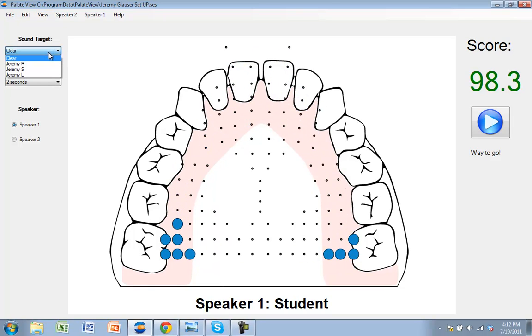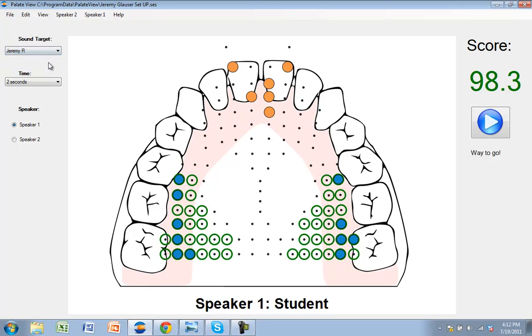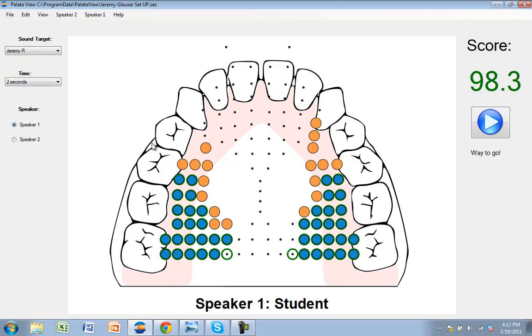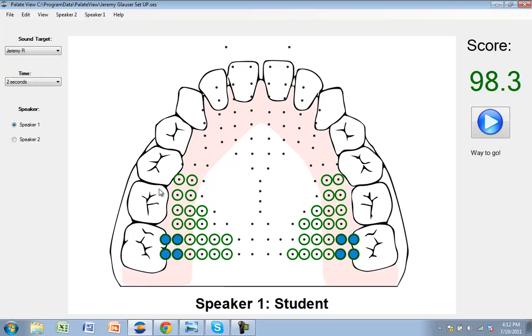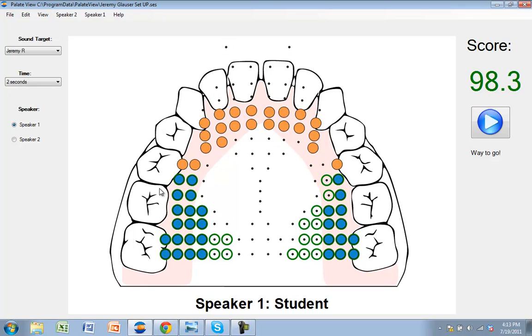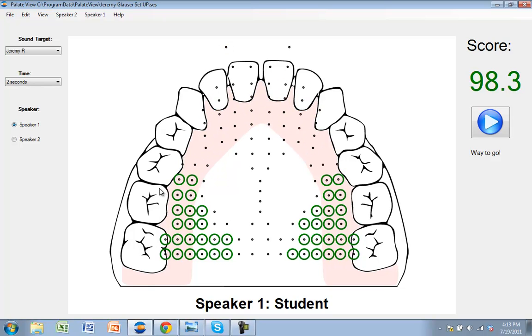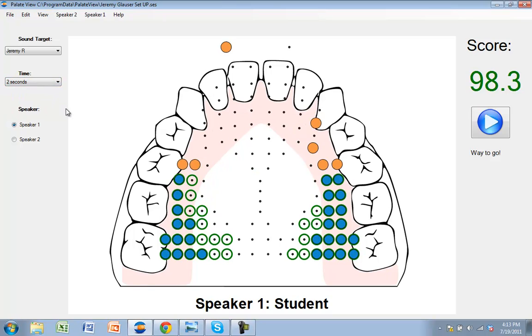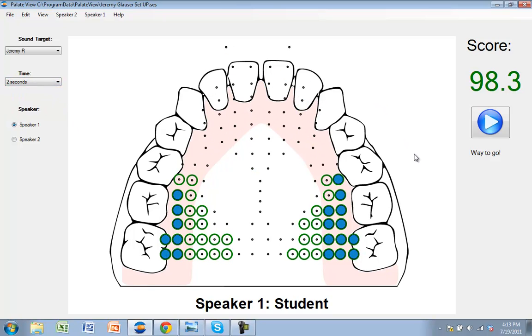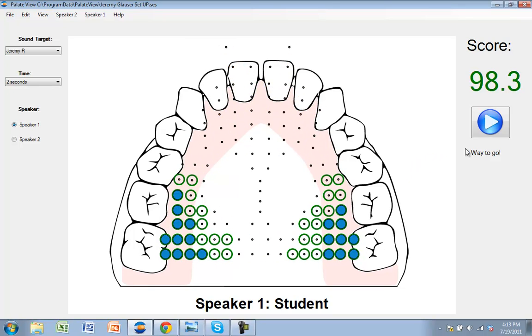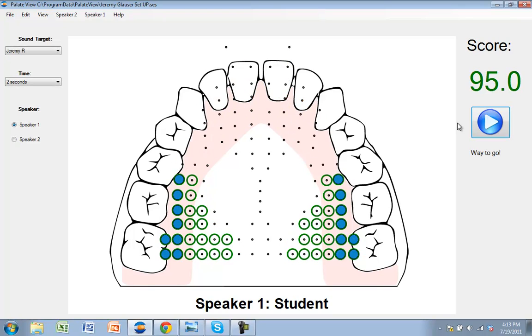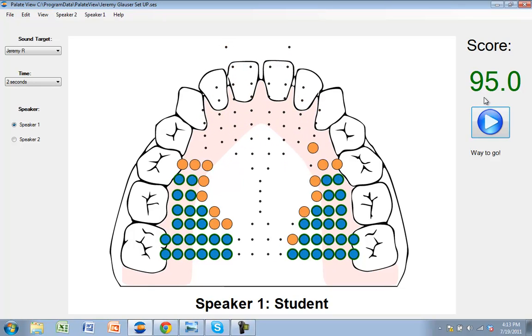In gold standard, the view that we're in right now, you can pull up a sound target. Let's pull up the sound R. The green dots on your screen are showing me where I should be lighting up the dots, or in other words, putting my tongue in my mouth to produce the sound R. I'm going to hold the sound R for two seconds, and on the right side, it will give me a percent score for how accurately I produce the sound R. So I made an R that was 95% accurate. That's pretty amazing.